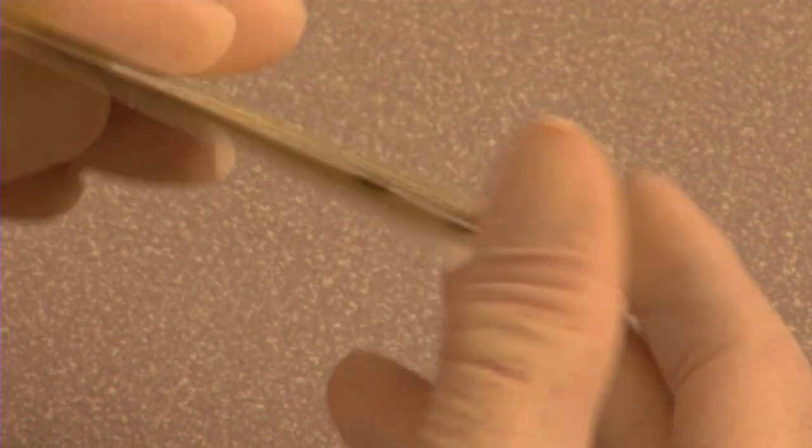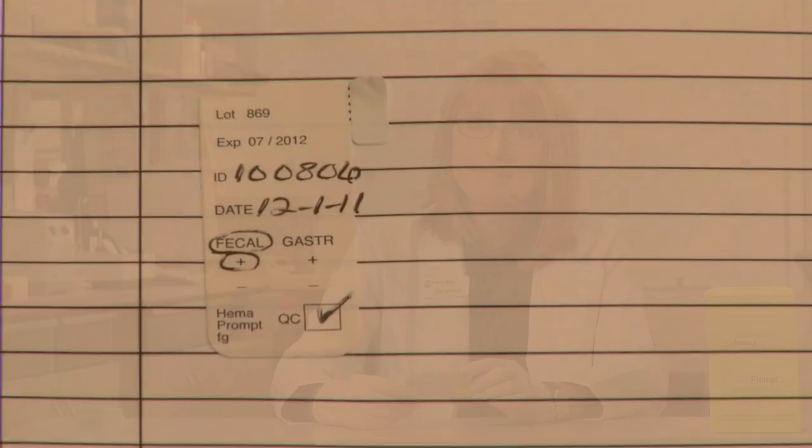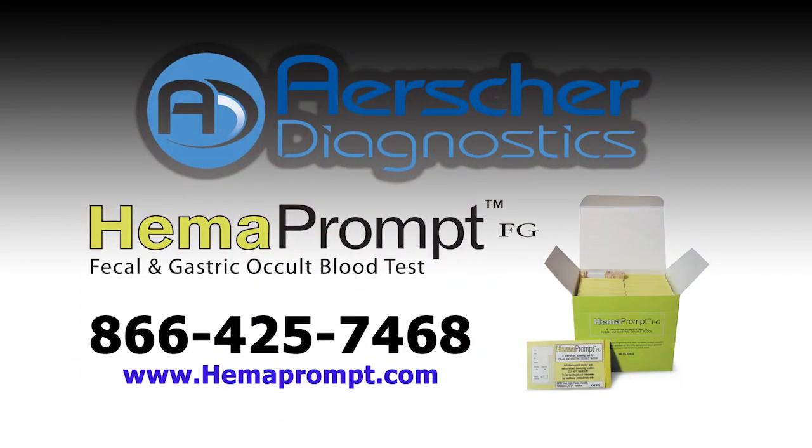When the test is complete, remove the label from the front of the card, and it can be placed on the patient's chart or on a test log. And that's all there is to it. Occult blood testing just doesn't get any easier. It's fast, reliable, all self-contained — it's the only 2-in-1 occult blood test, and it's competitively priced. So what are you waiting for? Lose the developer bottles for good. Call us today for your free samples so you can see for yourself what's developing with HemaPrompt FG.